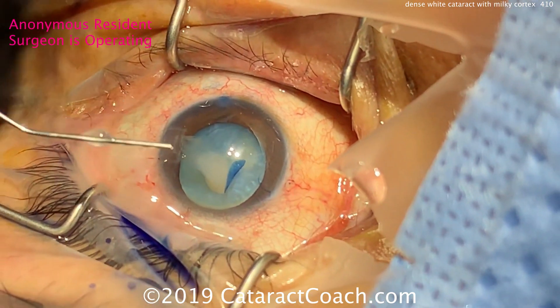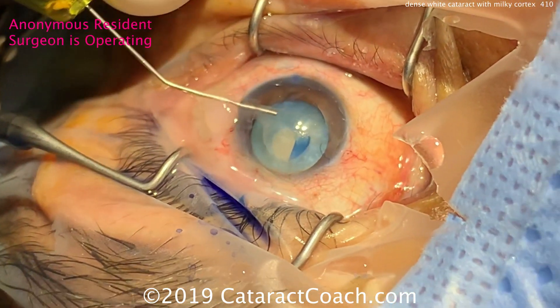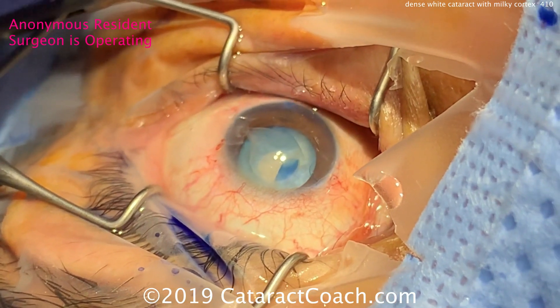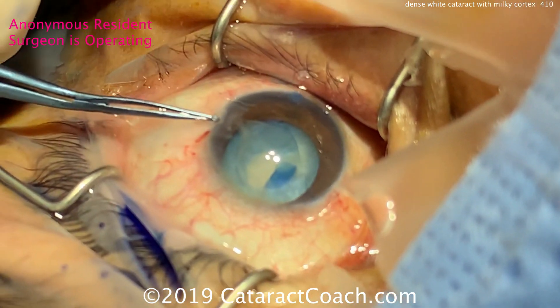Now the danger here is the capsular bag is pressurized, but the anterior chamber is not as highly pressurized. There is a main incision already, which will allow fluid and viscoelastic to egress from the incision.